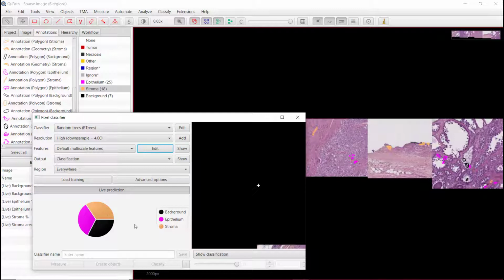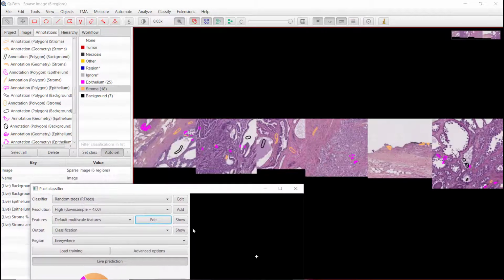And when we look at the whole number of pixels that have been annotated, we have something which is quite balanced, which is good. The goal is to try to find all the variability you could come across in your images, so all the different situations. Situations where it's just at the limit, where it's hard to tell between classes, are important as well to help the classifier.